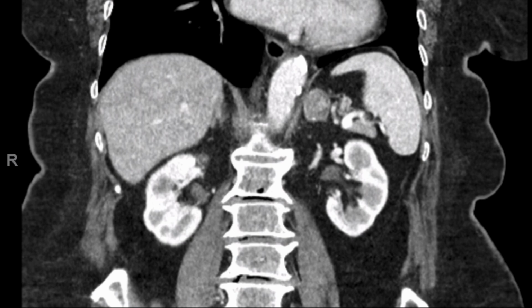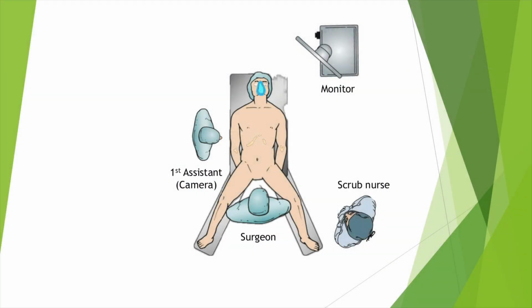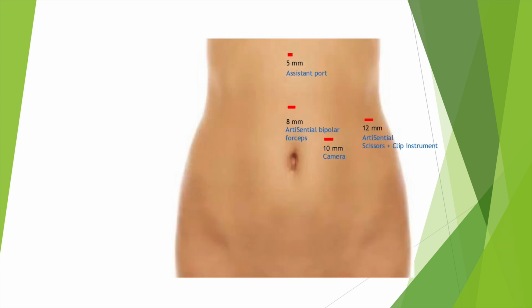The CT finding is demonstrated in this short sequence. The following illustrations provide a detailed depiction of the intraoperative setup and port placement.